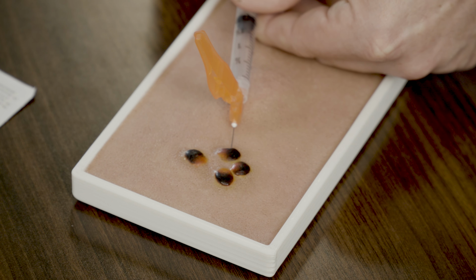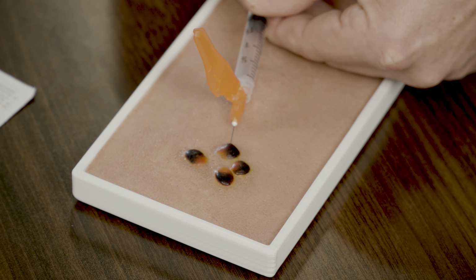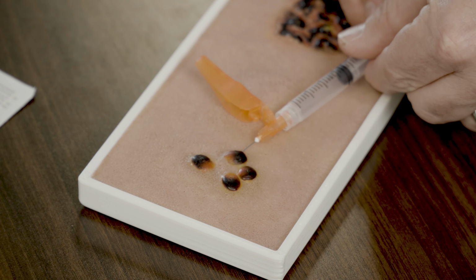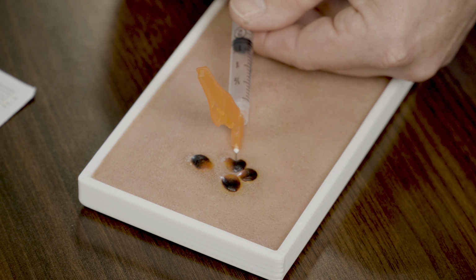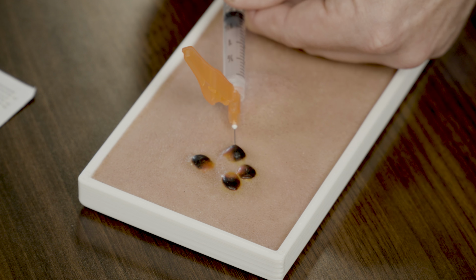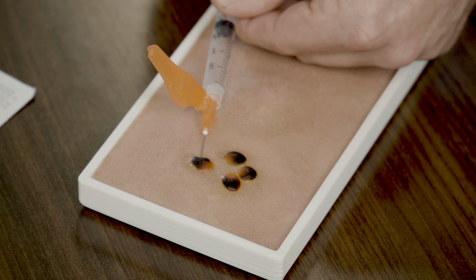Again, I would insert the needle at the very edge of the lesion, get it in the lesion, and start injecting as we pull it almost entirely out of the lesion, but not inserting it in through a separate stab incision, and inject through a fan technique. Gently aspirate as you remove the needle, and then you go straight to the next lesion.